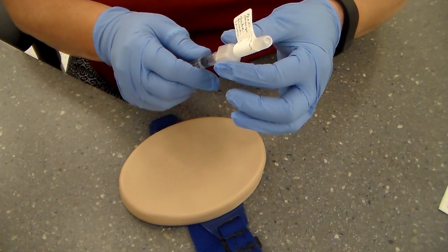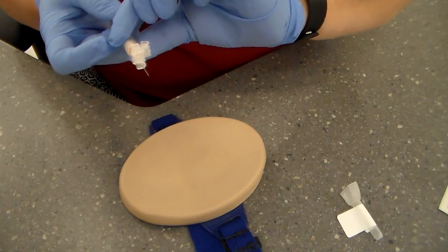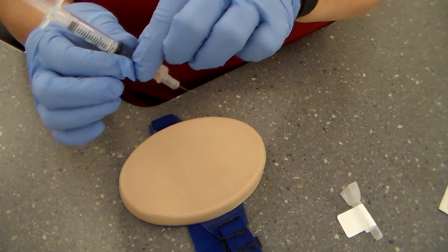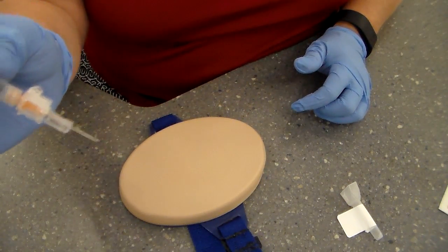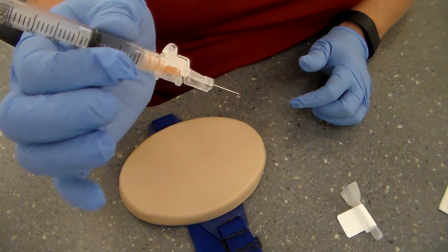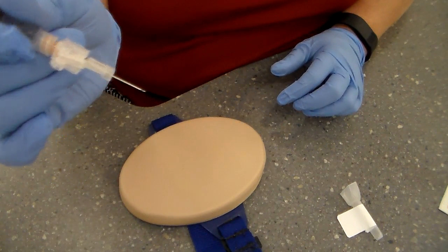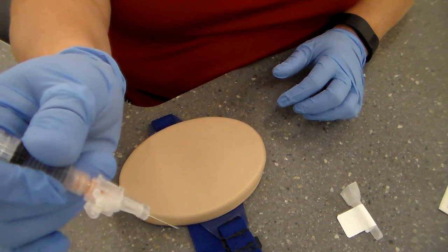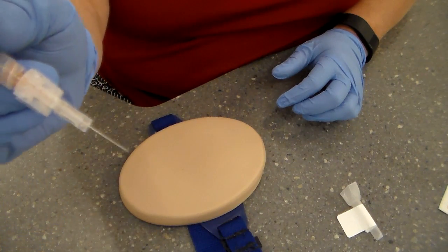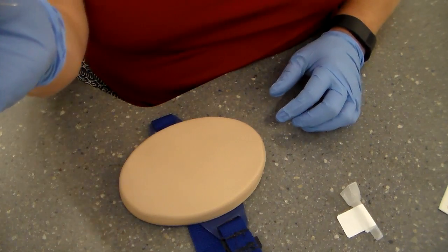So what you're going to do now is uncap your needle. And you're going to hold the needle like you were throwing a dart. So it's going to look like this. It looks like you're throwing a dart or you're holding a pencil. Most of you hold a pencil like this, right? That's how I like to hold it, like a pencil. So you're going to hold it like that.